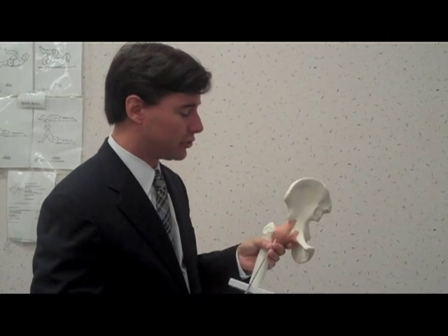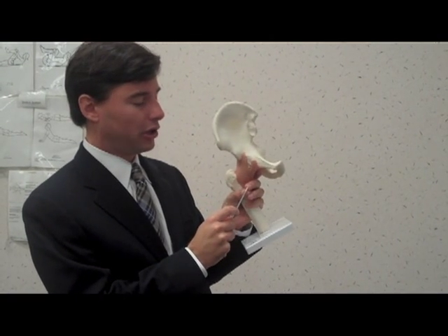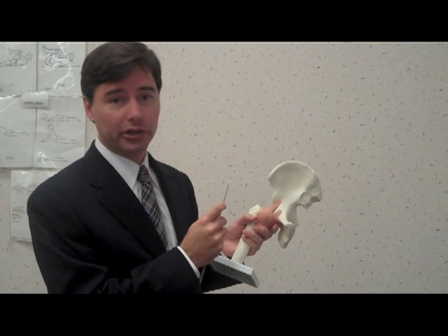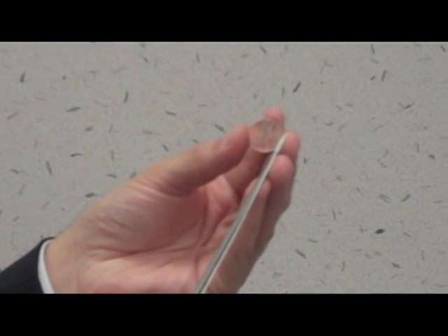The instrumentation that we use is very small. As you can see, this is what's called an anchor, and this small anchor dissolves over the course of six to twelve months. Your body actually will resorb this material while you're healing. This anchor itself, as you can see, is about the size of a dime — just smaller than a penny — and this really allows us technology that was not even available ten years ago.